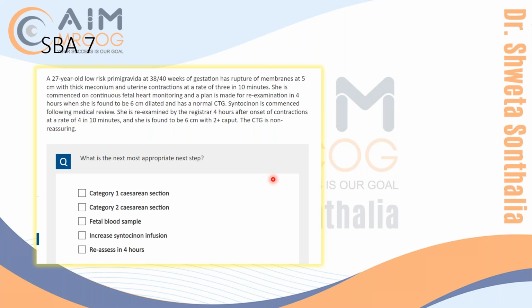Yeah, definitely. So it's not because of diagnosed delay, it's because of the syntocinon rule of 4 hours. Syntocinon commenced, re-examined 4 hours after onset of contraction and still no change in cervix. So 4 hours of regular contraction, no change in cervix, then it is cesarean. Everybody's clear now that this is what is written in NICE intrapartum?